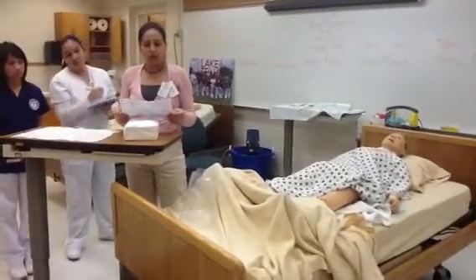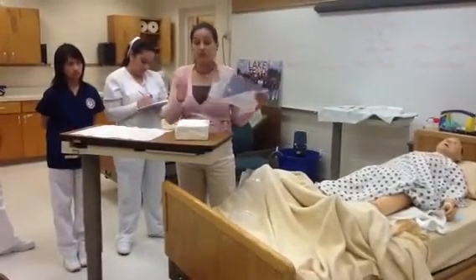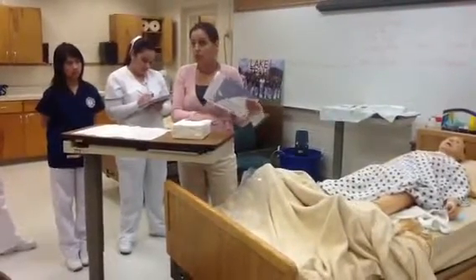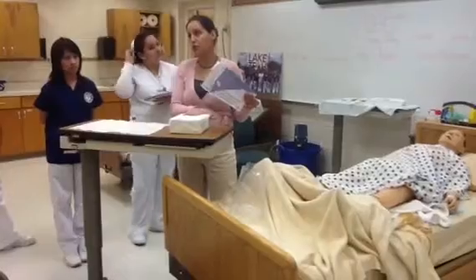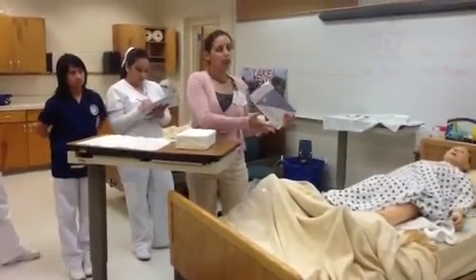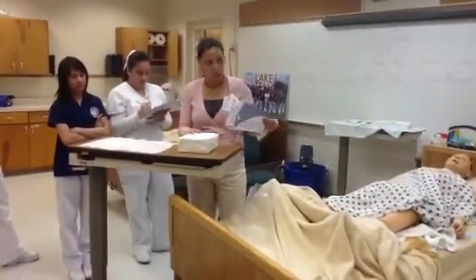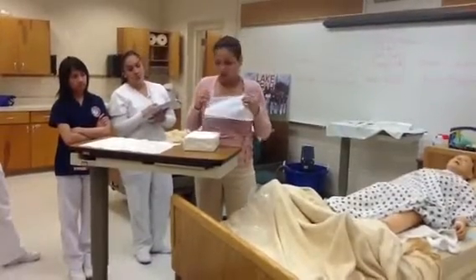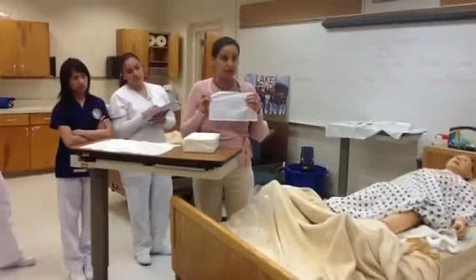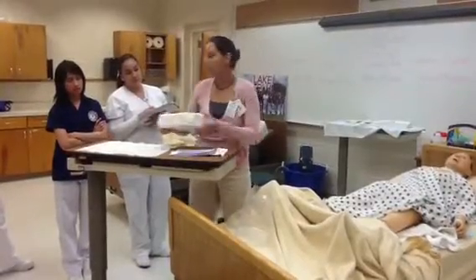The next thing that you need to do is review your directions, because some of these Foley catheters require you to check the balloon first. Some instruct you to not check the balloon first. You have to go with whatever the manufacturer says. That way, if there's a problem with the equipment, you have gone by the guidelines and are covered, okay? So you need to read all the fine print, usually it's in several languages, and find the number that says, do I fill up the balloon or do I not fill up the balloon? Do I test it or do I not test it?